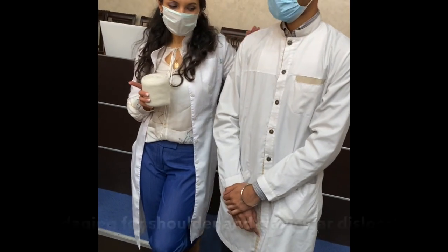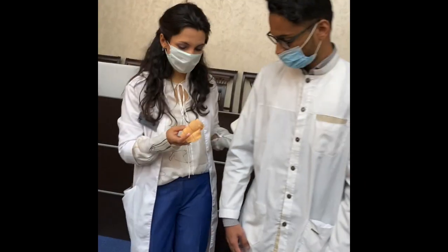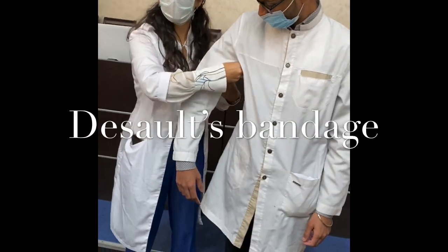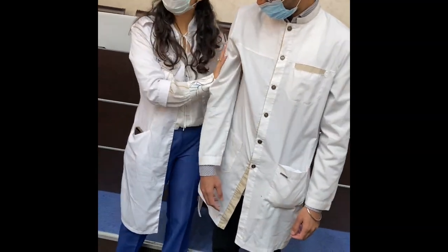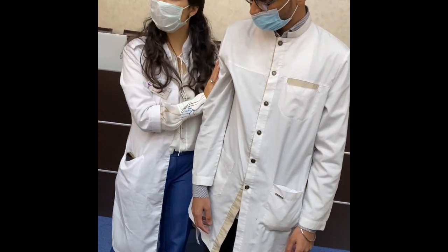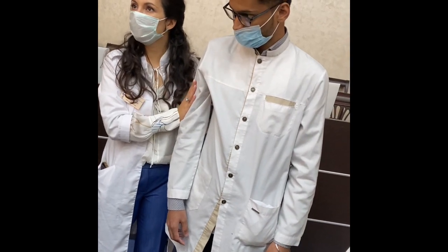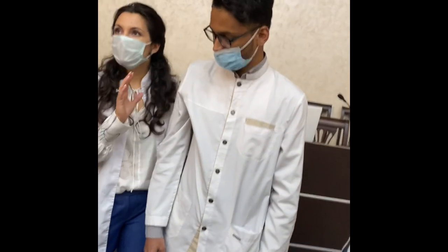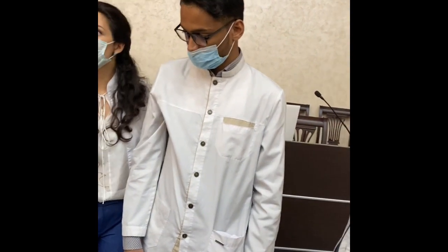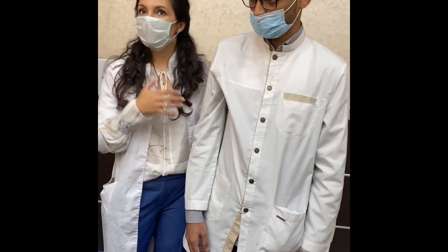Before we start, we have to put some support under the damaged area. But if the patient has a difficult fracture, we will not use any support, because it can damage more tissues and complicate the situation.